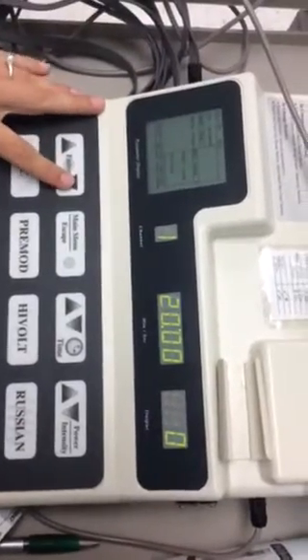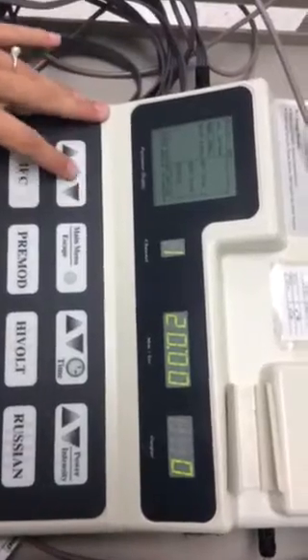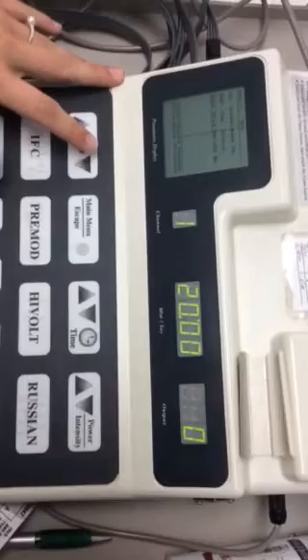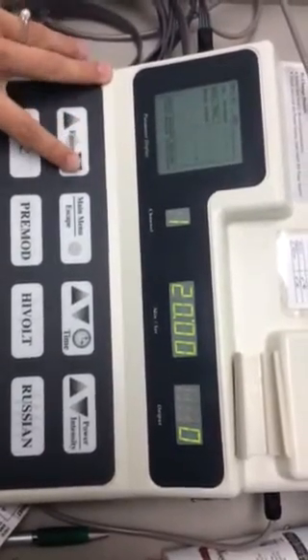It helps to prevent accommodation. You can set it on static and let it ride out. Or I guess we want to prevent accommodation, so let's set it on 40%.